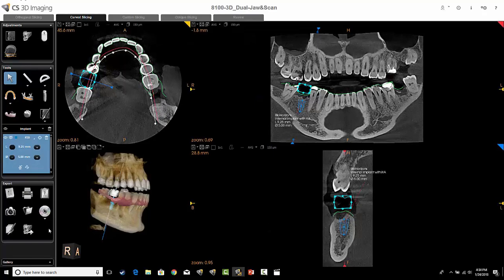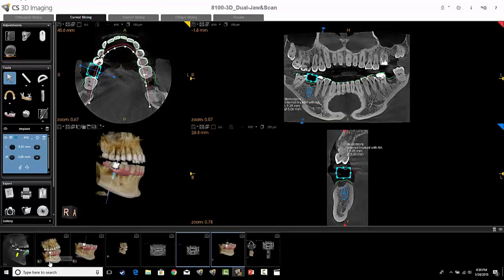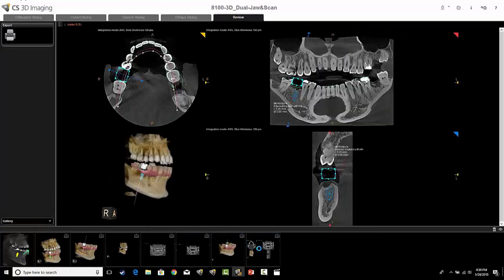The first option for capturing images is the camera icon on the left-hand side. That will capture whatever you see on the screen. Once you select that icon, down in the gallery you can see the image that was just captured. You can double-click on it and it will open up that image into the review tab.